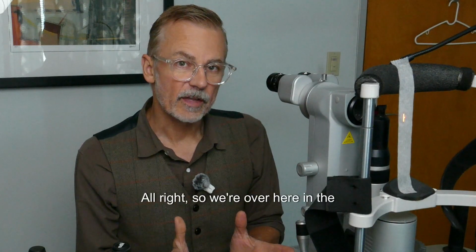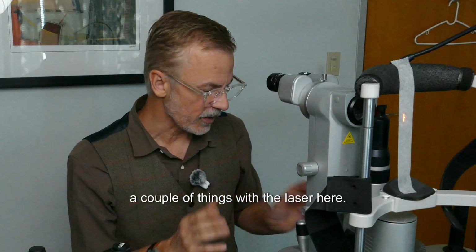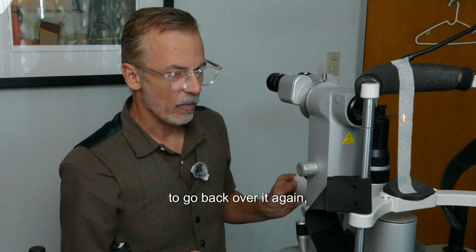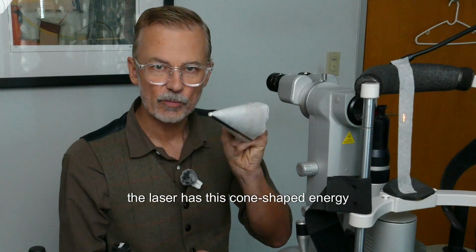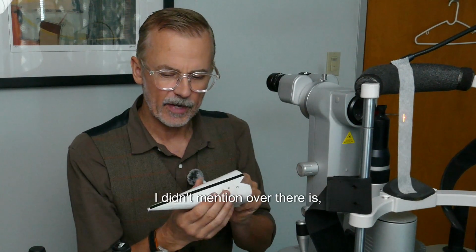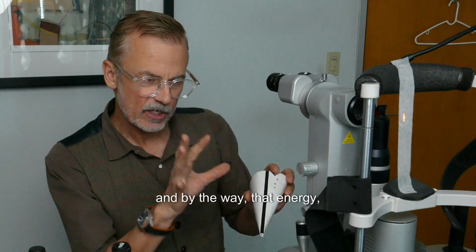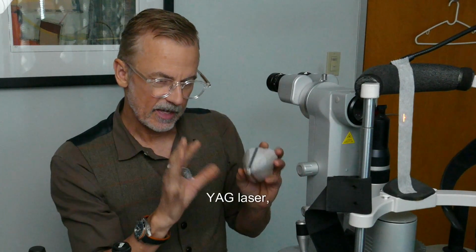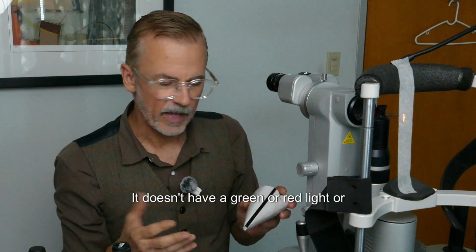All right, so we're over here in the treatment area, and I wanted to demonstrate a couple of things with the laser here. Just to go back over it again, the laser has this cone-shaped energy profile. What I didn't mention over there is, as part of the focusing mechanism, and by the way, the YAG laser energy is invisible. It doesn't have a green or red light or anything like that.